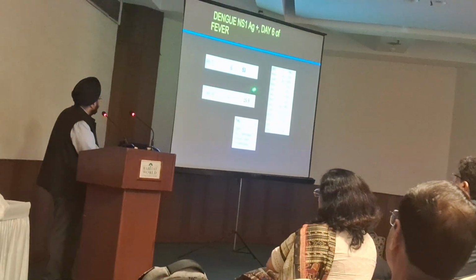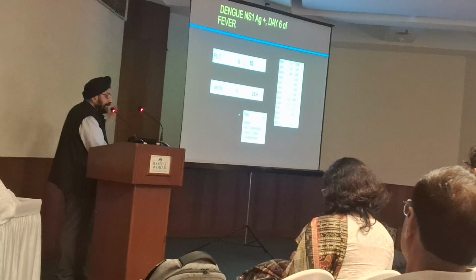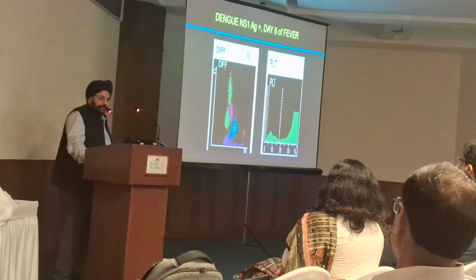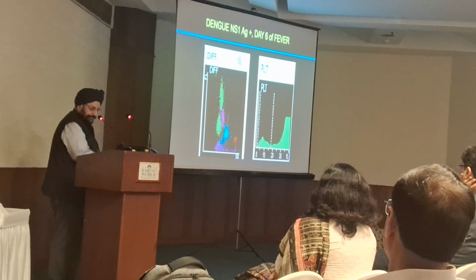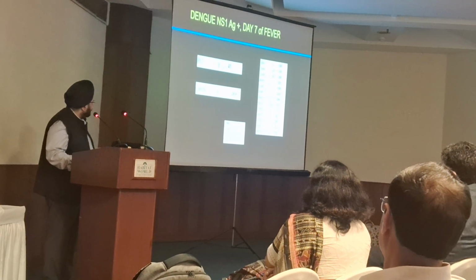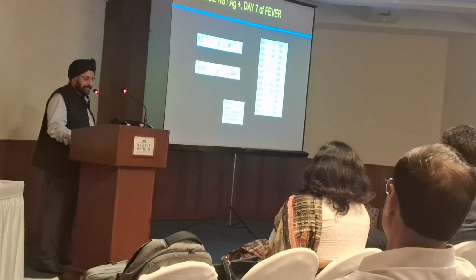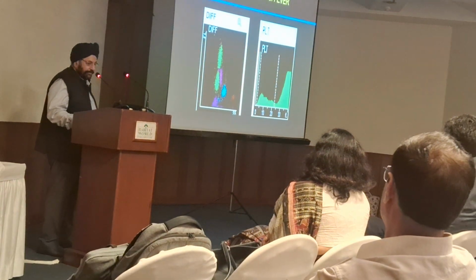Day 6, platelet count further went down to 53, HFC further increased to 15.9, but nothing like the previous time where there was a 13 times jump. This was just about a 2 times jump. On day 6, you can see the scatter plot is now more intense for the HFC. Day 7, platelets decreased further to 41, HFC has gone up to 19.9. On day 5, we had seen that jump, so probably the next day it should definitely improve. It's already plateauing. This is the scatter plot.